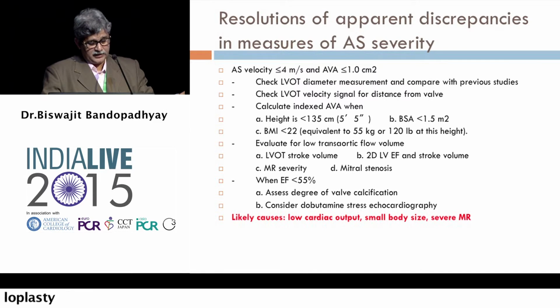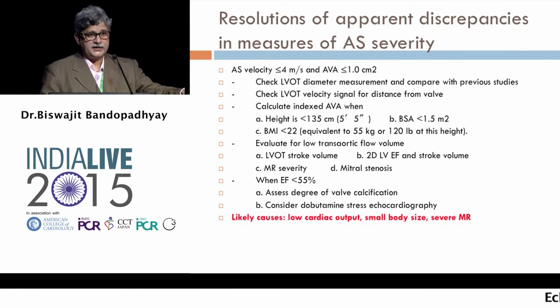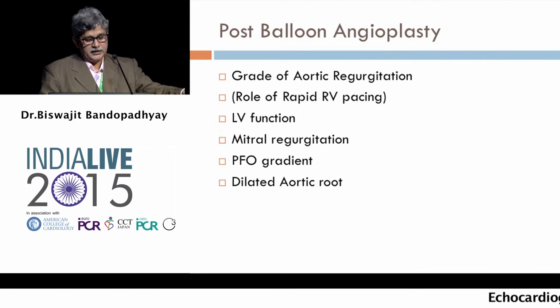In those, the likely causes are low cardiac output, small body size, or any severe MR. So these things we have to keep in mind before actually assessing the degree of severity. And post-balloon angioplasty echocardiography is very important.